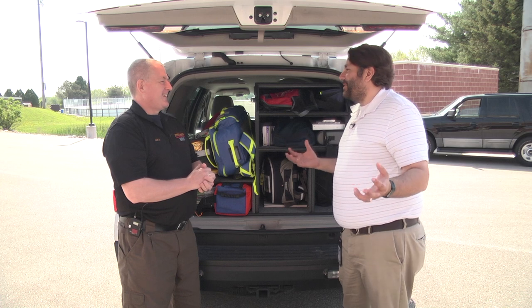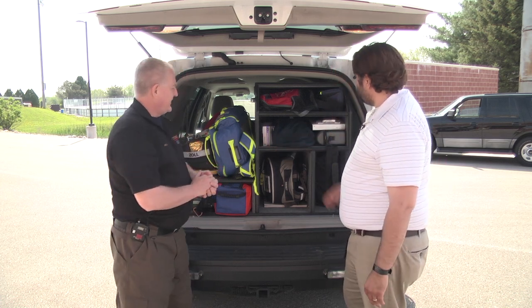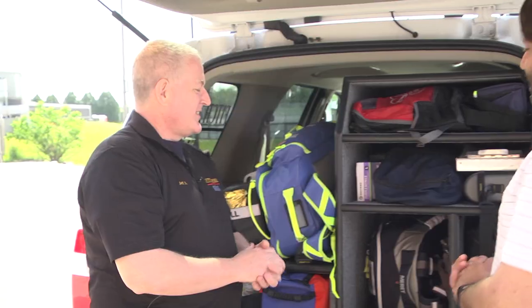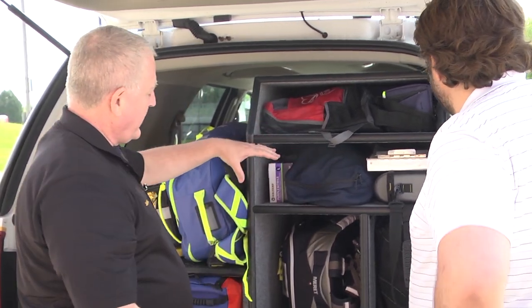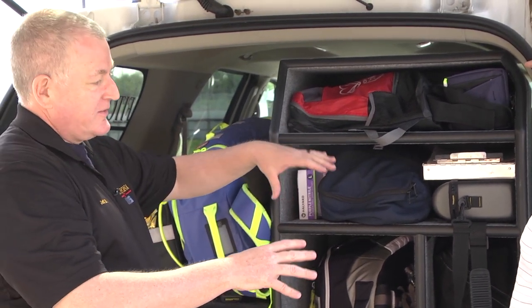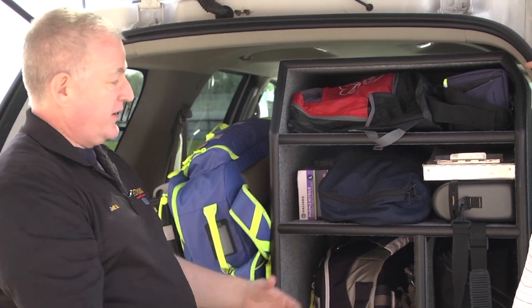Yeah, this vehicle is full of so many great things. I'm just excited. I'm an EMS guy, so of course I'm going to be excited about this. But take us through what we've got here. Let's open all these bags up. Let's do this. So in this compartment right here, just a couple things. It has what we call the intermediate or IV tech advanced level care. So it doesn't have all the paramedic drugs, but it has the basic stuff that we can get started.